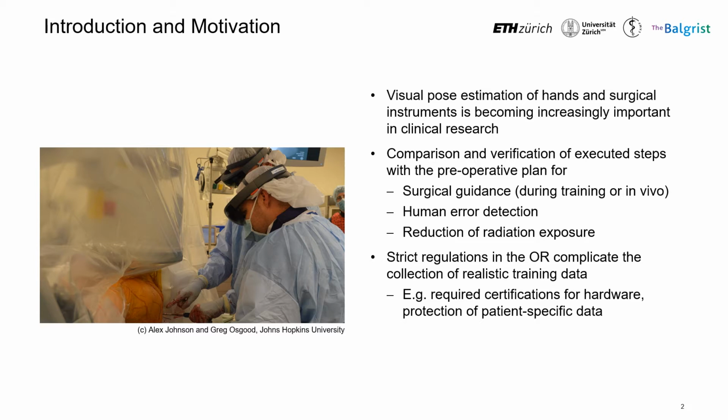in clinical research. Knowing the exact pose of surgeons' hands and surgical instruments paves the way for new applications that can optimize the outcome of a surgery by providing surgical guidance, reduce the likelihood of intraoperative complications via automated human error detection, and reduce the radiation exposure for patient and staff.